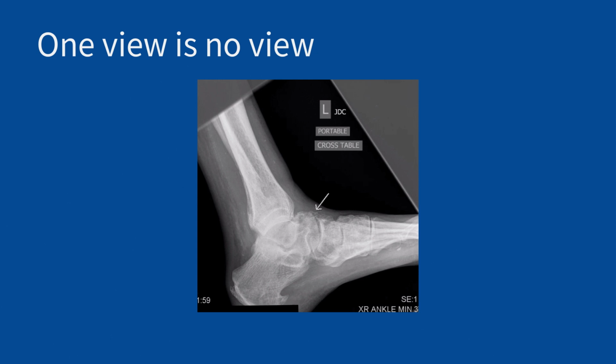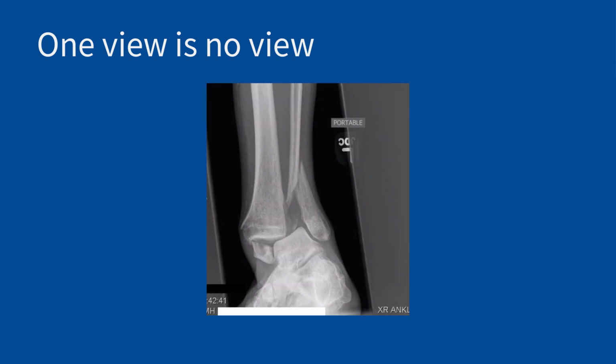Moving into the pediatric realm, so here a lateral view that was obtained. I can't remember the details. I think the patient had some difficulties holding still, so they only got one view. And you can see this little tiny fragment there. And once they were able to complete those pictures, we actually see a pretty significantly dislocated fracture there, which gave us this little fragment that we saw, but really very little indication on the lateral view otherwise.